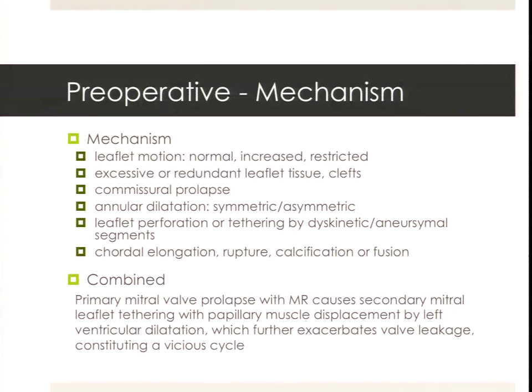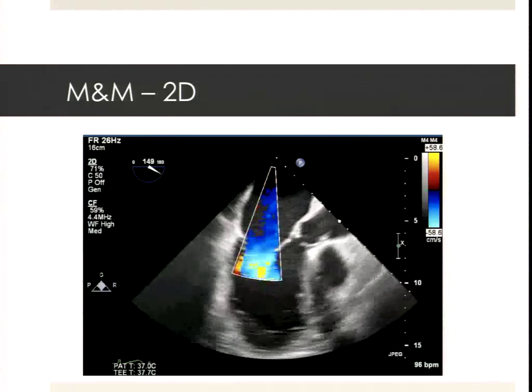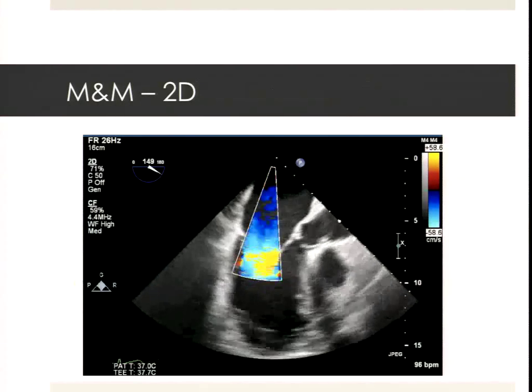Those sorts of things. And bearing in mind, pathologies tend to combine. Once you have a primary pathology, it tends to go on to a secondary pathology to sustain itself. So when you look at just simple MR, this is classic restriction, but what you should be doing is focusing on where the pathology lies.